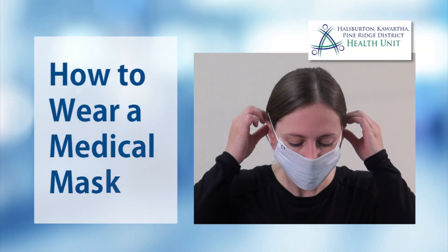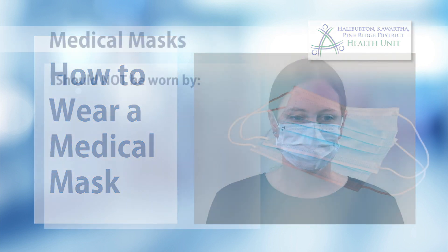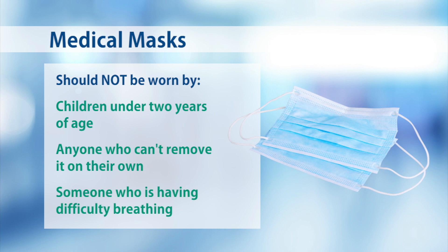Having your staff or volunteers wear a medical mask can help prevent the spread of COVID-19. Masks should not be worn by children under two years of age, anyone who can't remove it on their own, or someone who is having difficulty breathing.